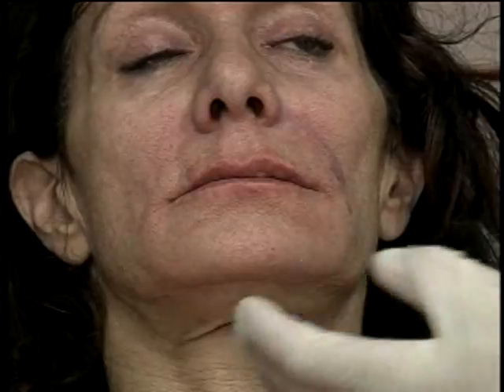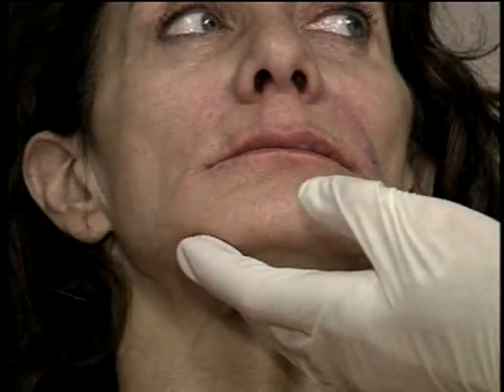Next area we'll go to treat is the pre-jowl sulcus. This is Perlane, and because it's a thicker product, we use a 27 gauge needle. Right now I'm using a 1/2 inch needle. You can use a 1.25 inch also. And because it's thicker, you have to use a larger lumen so that it can be expressed without too much effort.